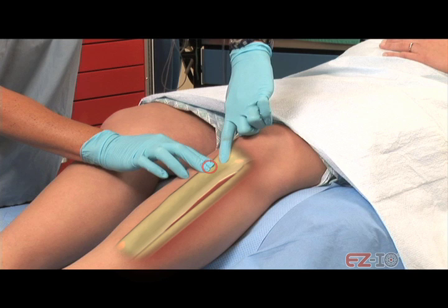The insertion sites for pediatric patients are the same as those for adults. In small children, generally under the age of 2, the tibial tuberosity may be difficult or impossible to locate. If the tibial tuberosity cannot be palpated, locate the distal aspect of the patella. Move approximately 2 centimeters distally, depending on patient anatomy, and then medial to the flat aspect of the tibia.